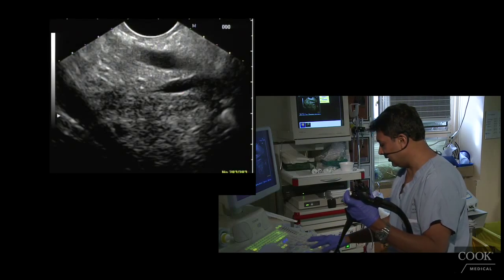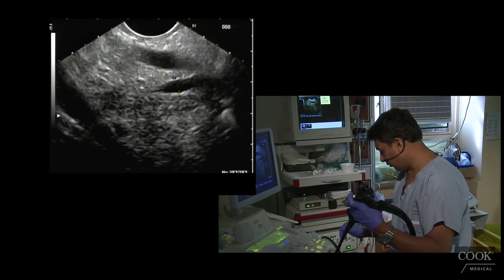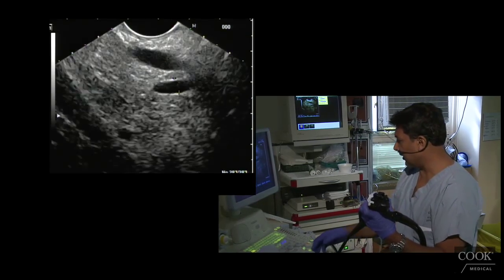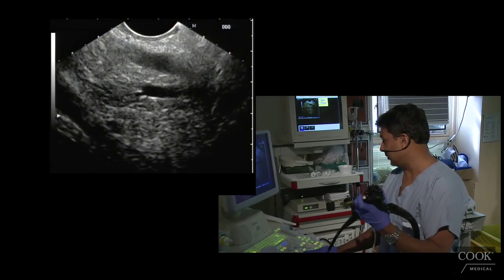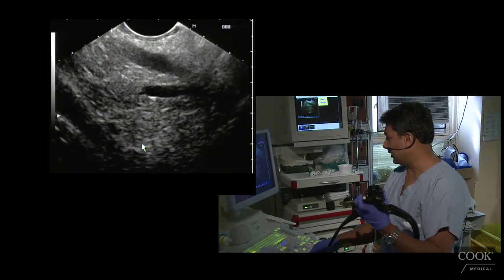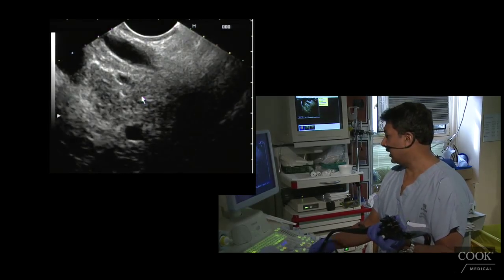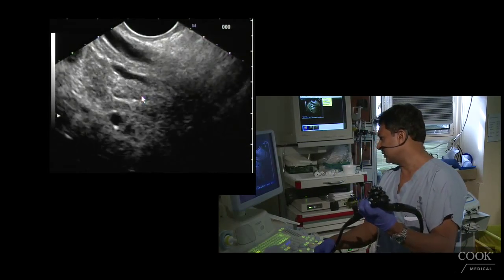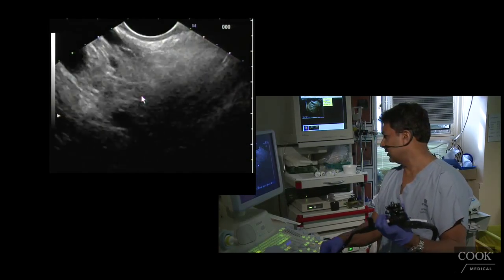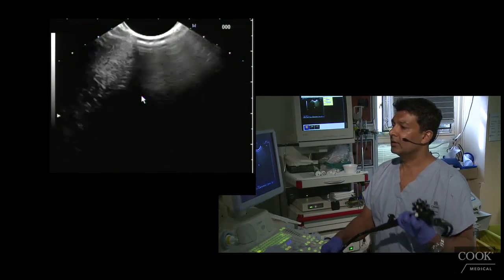His ventral PD here is somewhat large, looking anyway, 4.7, so that it should be theoretically less than 3. So far, all I'm seeing is just chronic pancreatitis. You can see one branch heading off into the uncinate here. You can see his pancreatic duct goes well out of the ventral pancreas into the dorsal pancreas, so no divisum. So far I'm just seeing chronic pan and that's it. So I don't know what I saw last time because I'm really not seeing anything exciting here.